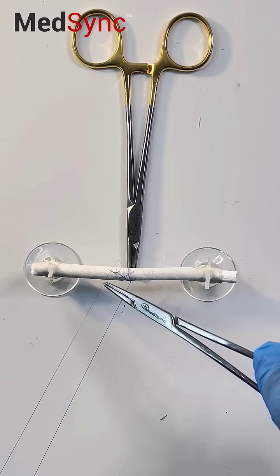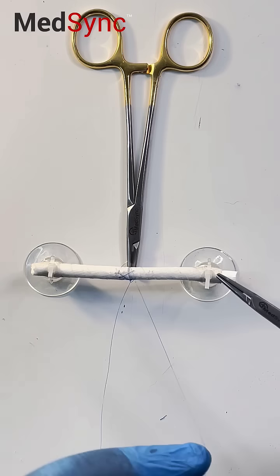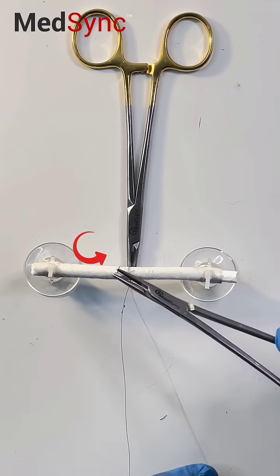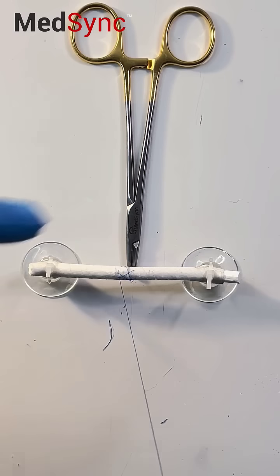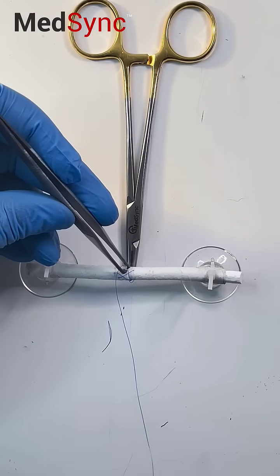But don't get caught in the loop. Instead, push the suture over, rotate the needle, mount it straight away, and guide your suture down.